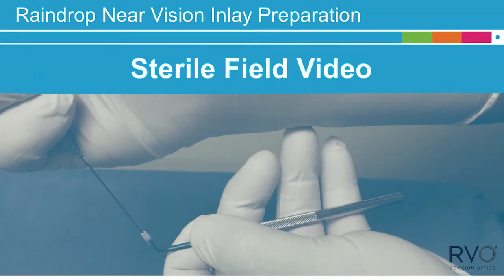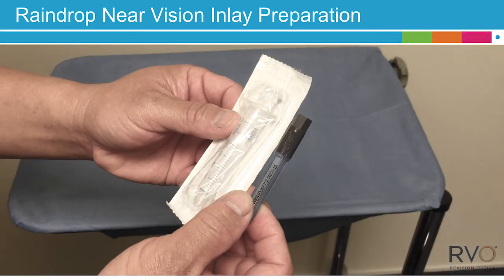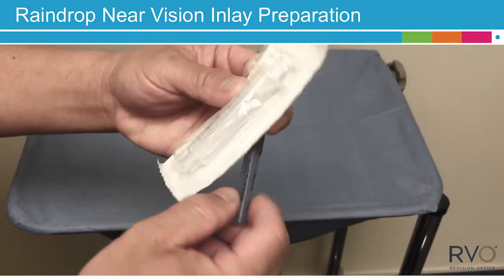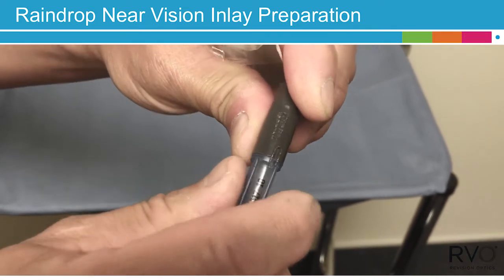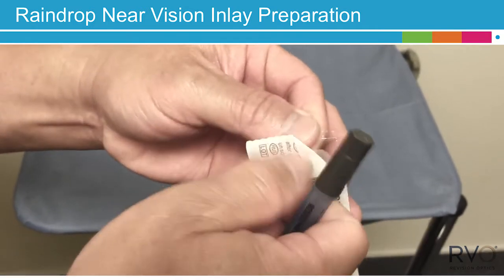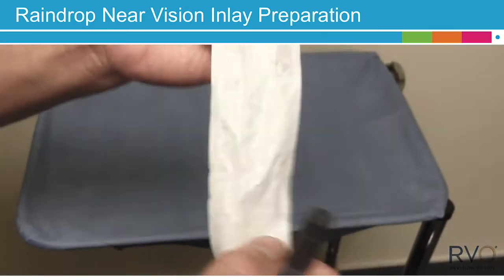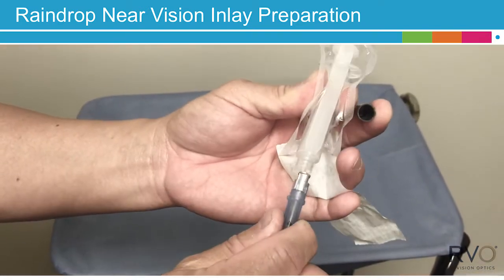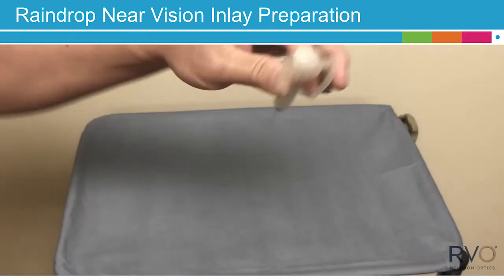Begin by preparing the sterile syringe cannula assembly by holding the cannula package as shown. Gently break the seal by applying pressure with both thumbs. Partially remove the sterile syringe from the blister pack to expose the luer fitting, being careful not to directly touch the syringe. Twist the cannula hub onto the end of the syringe until it is tightly connected. Hold the completed assembly away from the non-sterile cover and transfer it to the sterile field.